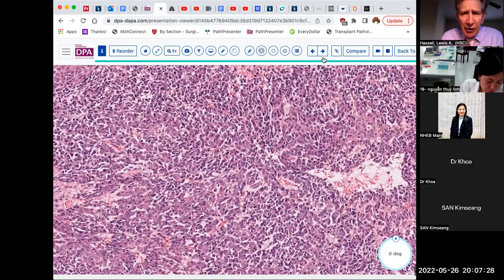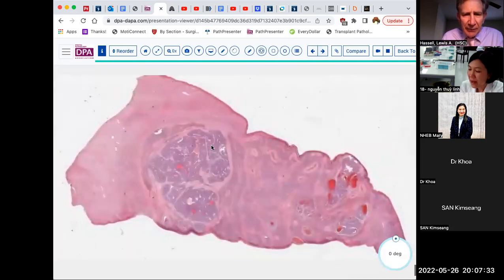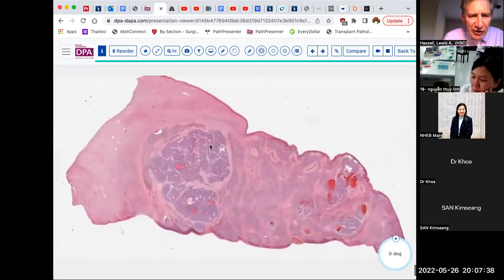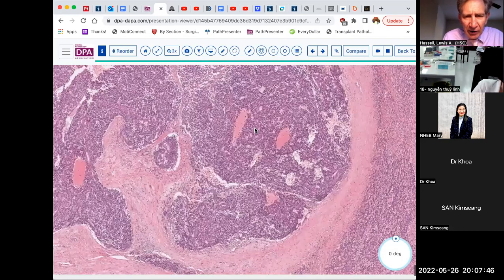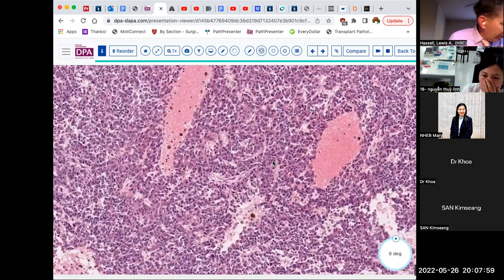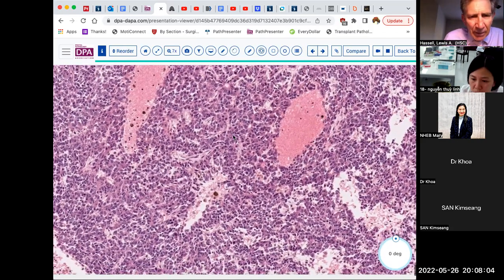Now, usually immunohistochemistry is not required in this setting, but if we need to do it, there are characteristic findings. Of course, the tumors are usually very strongly positive for AFP. That would be a helpful marker. They'll also stain with some liver markers like HepPar or glutamine synthetase and so forth. They may also have CEA and various cytokeratins, such as cytokeratin 7 and cytokeratin 19.